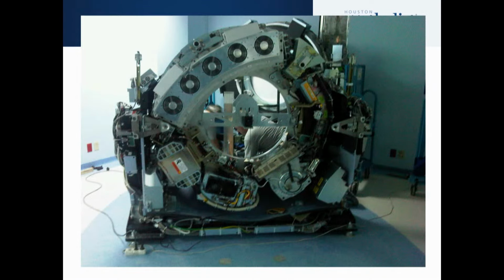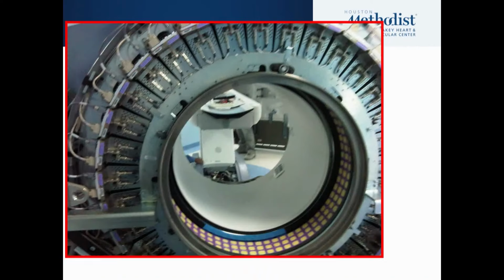So we're going to focus first on the PET part, because the CT part was already discussed by Dr. Cheng a few weeks ago, where there is an X-ray tube and there is the detector. You emit X-ray and you detect it on the other side by the detector. While on the PET side, when I zoom a little bit more on this, now you see these rings that are around the patient.